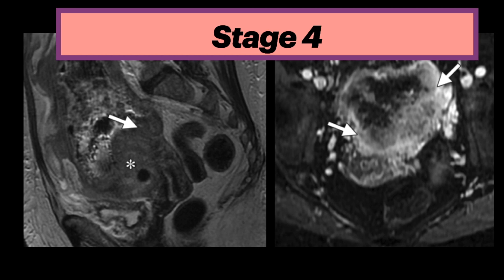Here is stage 4a endometrial cancer. The sagittal T2 on the left shows a large endometrial tumor invading the sigmoid colon, as evidenced by loss of the normal fat plane between the tumor and colon, denoted by the arrow. The contrast-enhanced MR on the right shows invasion of the sigmoid colon by the enhancing tumor, confirmed at histologic analysis.